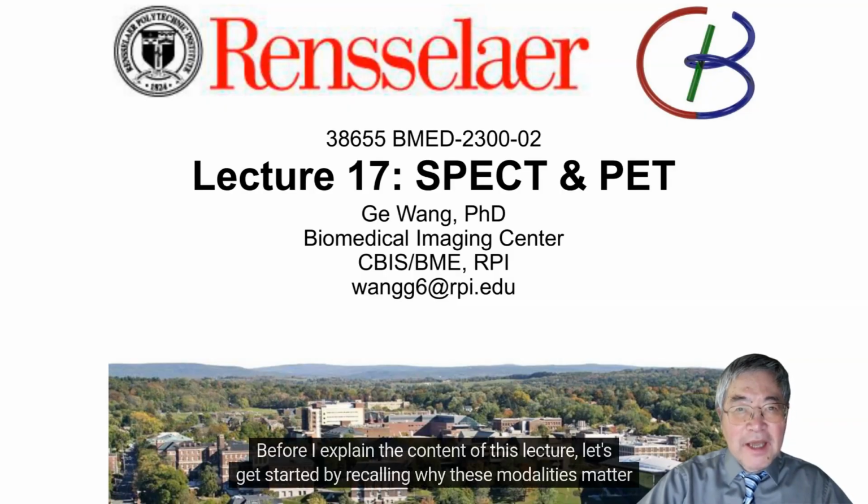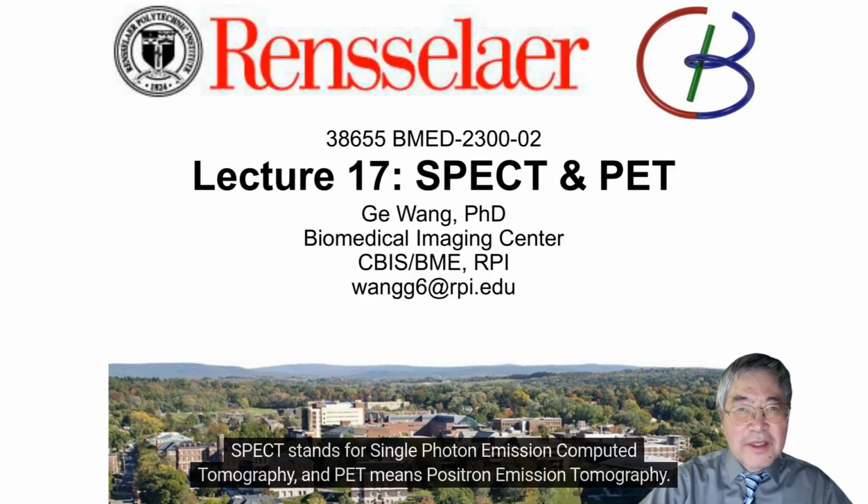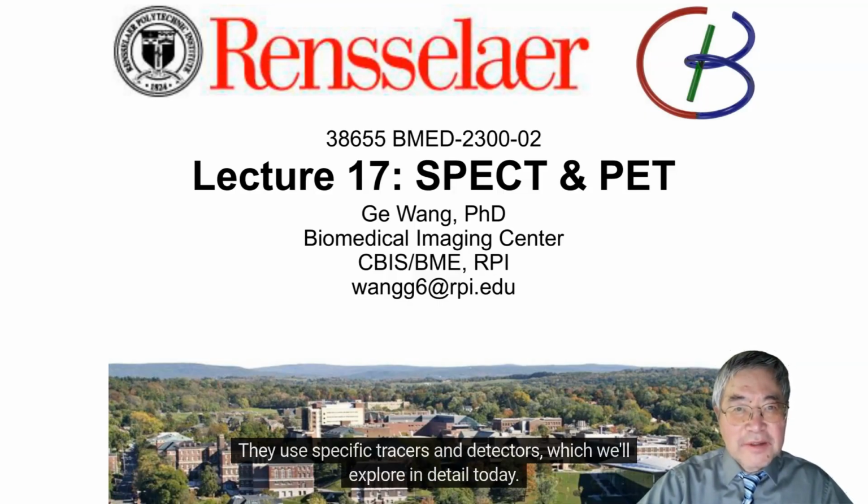Before I explain the content of this lecture, let's get started by recalling why these modalities matter in biomedical imaging. SPECT stands for single photon emission computed tomography and PET means positron emission tomography. Both enable molecular imaging and are vital for diagnostics and functional evaluation. They use specific tracers and detectors, which we'll explore in detail today.